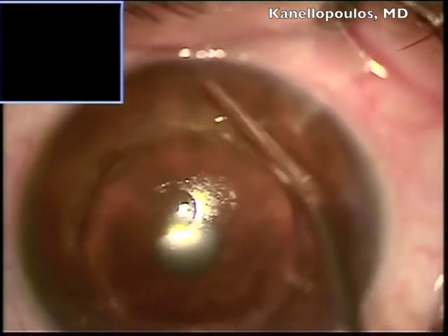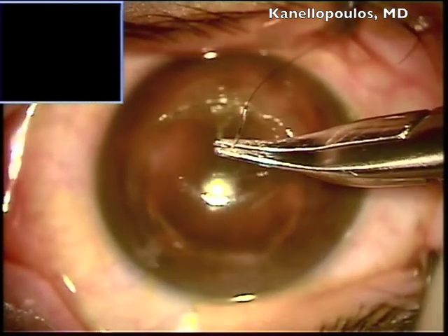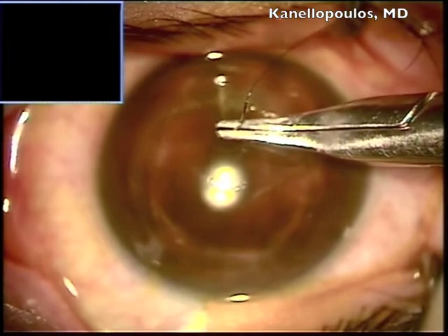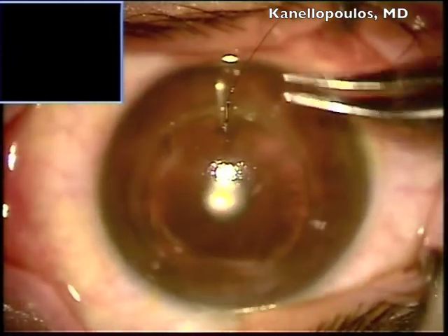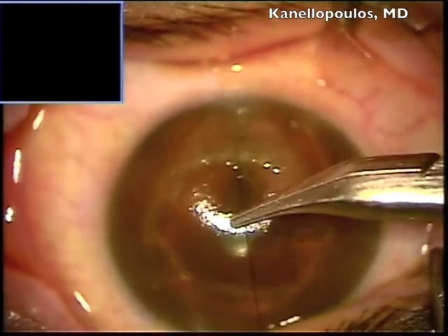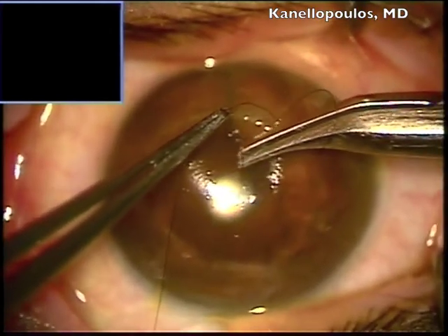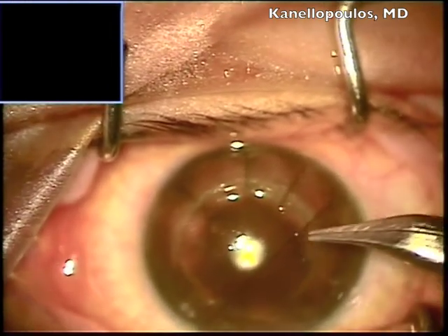And now we soak it with Vibex Extra — this is a 0.3% riboflavin — and I will do this all along while suturing this inferior part of the graft-host interface, so about 180 degrees worth of that interface. You can see the sutures are placed almost full thickness, suturing quite tight here. I'm trying to bunch up all the loose tissue and obtain, if possible, an overcorrection.